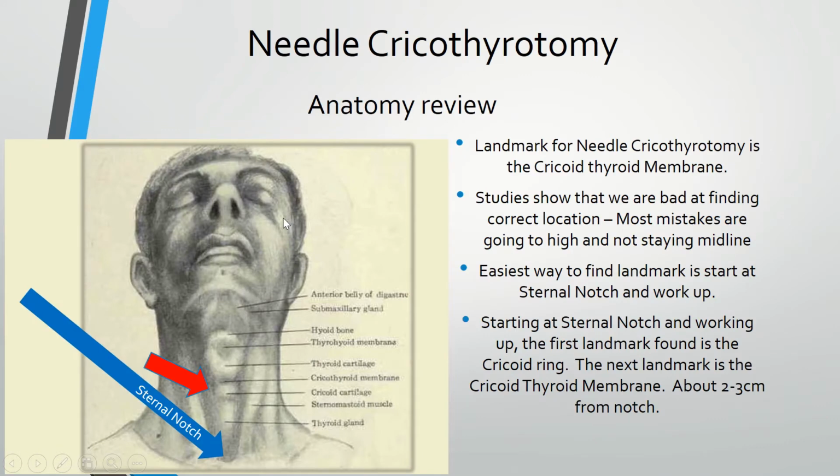Okay, real quick anatomy review. The landmark where we perform this needle cricothyrotomy is the cricothyroid membrane. I've been doing this for 25 years, and I was always taught to start at the top and work your way down. Some of the studies I've researched show that a lot of people are going too high and not staying midline, and we're losing the landmarks. So a lot of the studies now are teaching you to start at the sternal notch, which is easy to find on most patients.